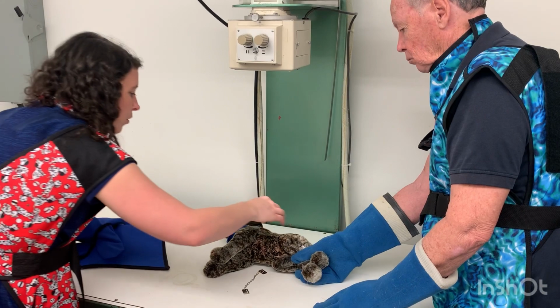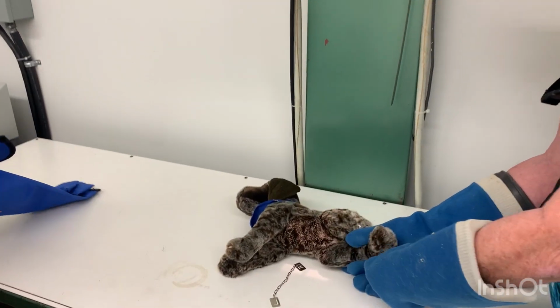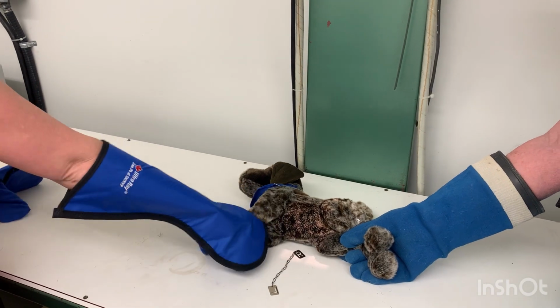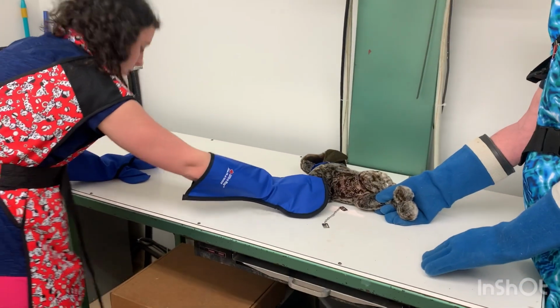And we want to make sure too that the spine here is going to be nice and straight. So our spinal processes will be all in line with each other, all parallel. So that would be pretty good.